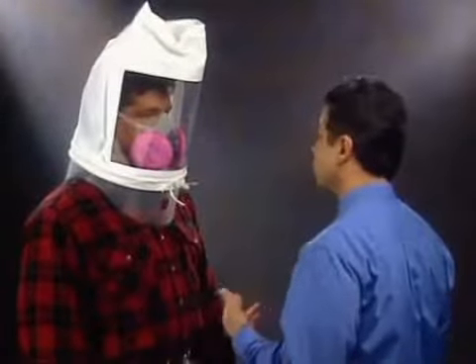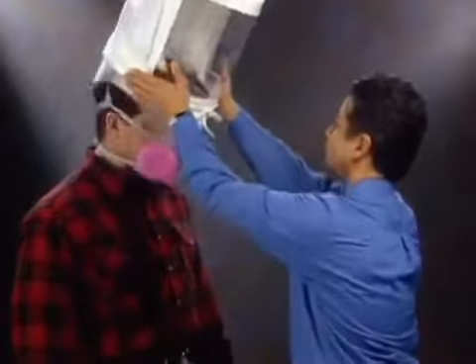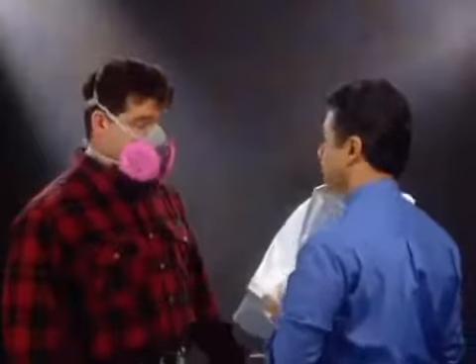If you complete the exercises without tasting the test agent, the respirator fits you properly. When it comes to respiratory protection, you must have a proper fit. Your health depends on it.